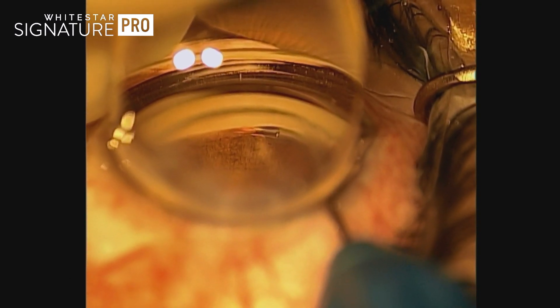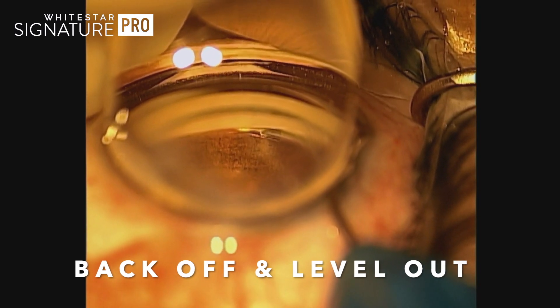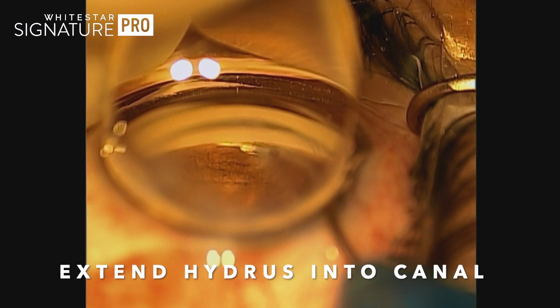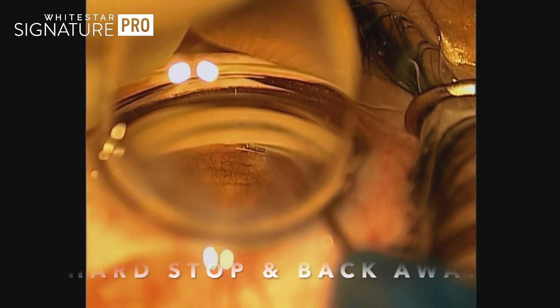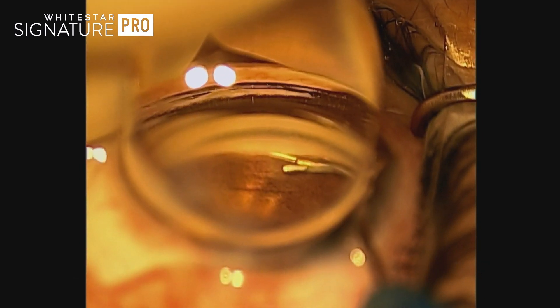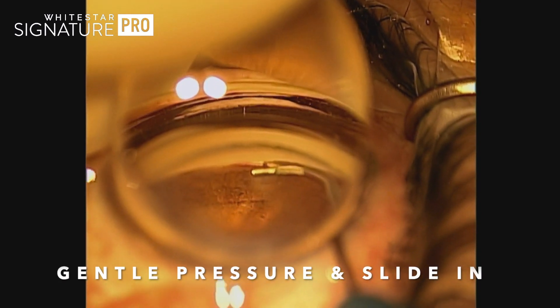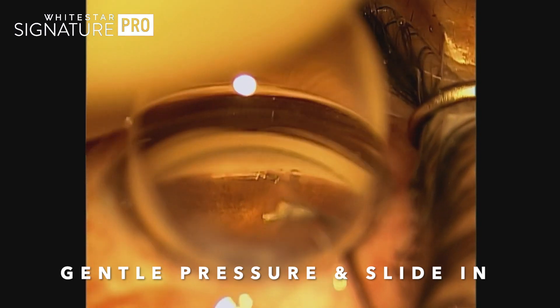You've still got pretty good back pressure at this point getting that first eyelet in. But once you do, let off just a touch — still stay married to the posterior wall but less pressure — level out, and then go ahead and inject. You can see the Hydrus sliding in very nicely. Come to your hard stop, slide back and away, and just gently tuck the Hydrus in so about half of the first window is covered by TM.